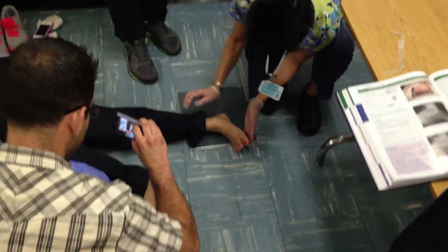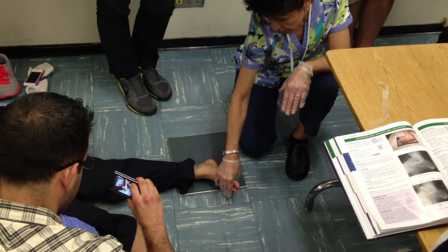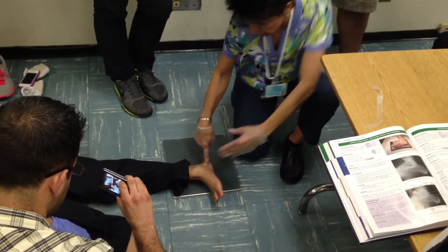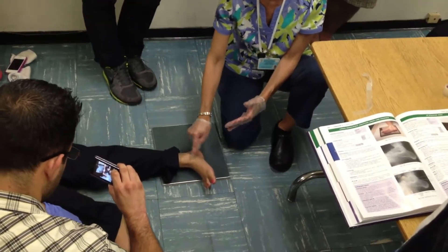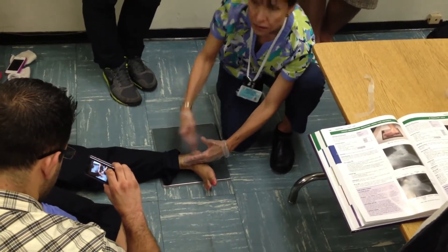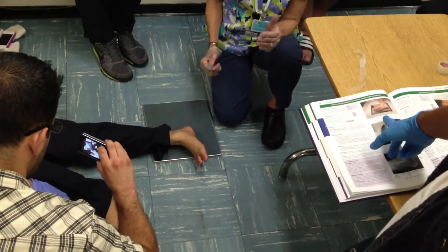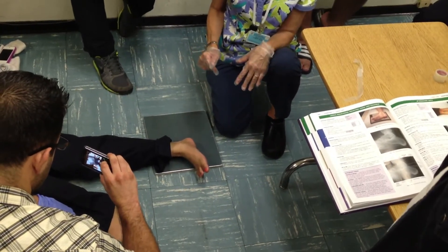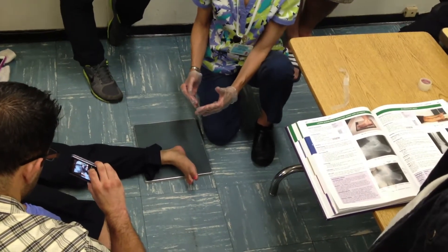On the lateral heel, it needs to be dorsiflexed. We don't do this. It needs to be dorsiflexed. My CR is going to be there, and I'm going to call it eight. You need the talus — the talus sits high. You want CR perpendicular. And that's what the foot requires. You're done with the heel — lateral heel, mid-heel.